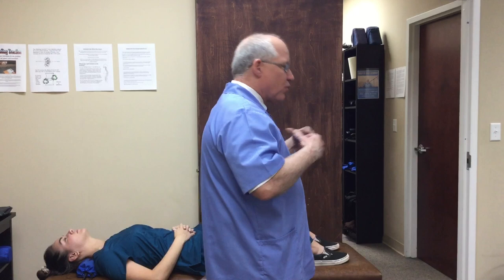Good morning, this is Dr. Hartley from Hartley Chiropractic and Scoliosis Center. This morning we're going to be talking about the cervical vibratory traction. This is a very important tool that we use with all our patients, not just scoliosis patients. Most people in the United States today have forward head translation with the loss of the cervical curve.